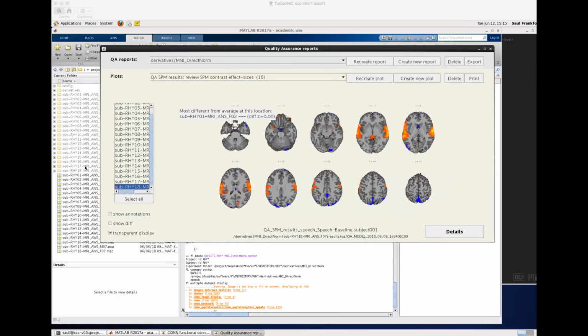Okay. I think those are all the major ones. I'll look through these again, and based on the knowledge that I've gained in this brief session, if there's anything else, I'm anxious to see what happens when we add those other higher order motion regressors. Oh yeah, yeah.